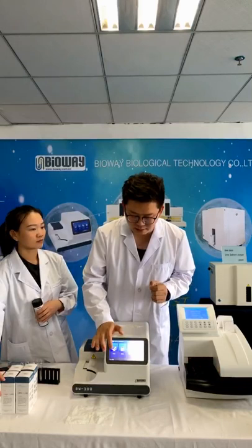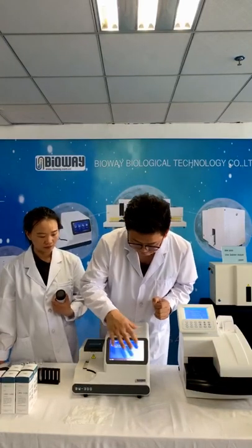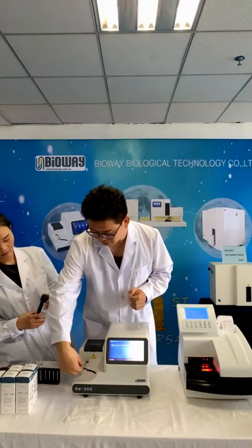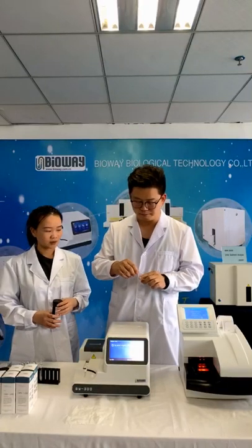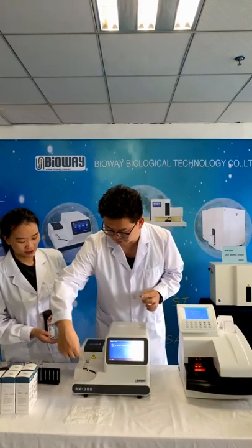For the test, it's easy to use. Just click the test icon. Now the testing process starts. We put the strips on the area. So you can put the strips on constantly.